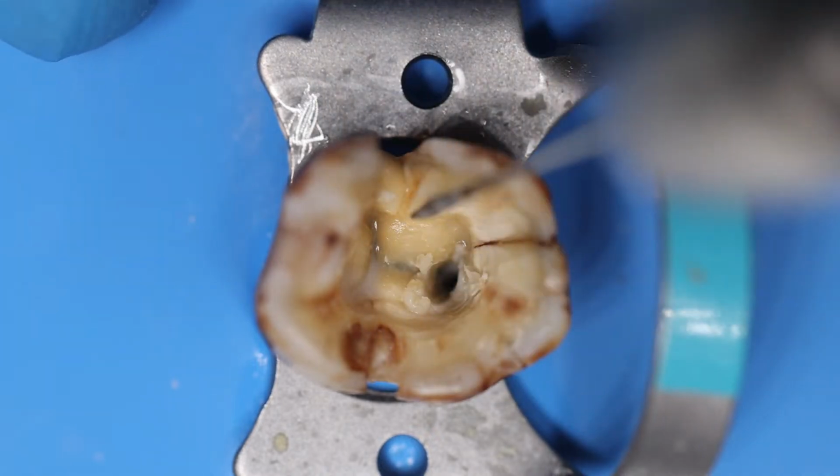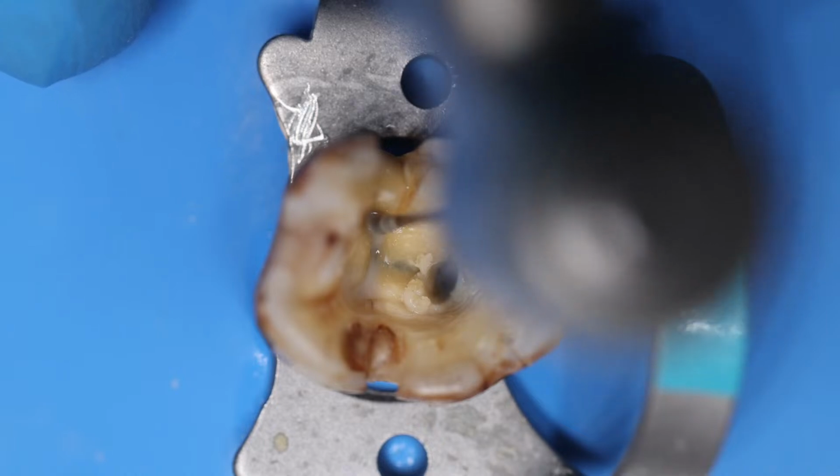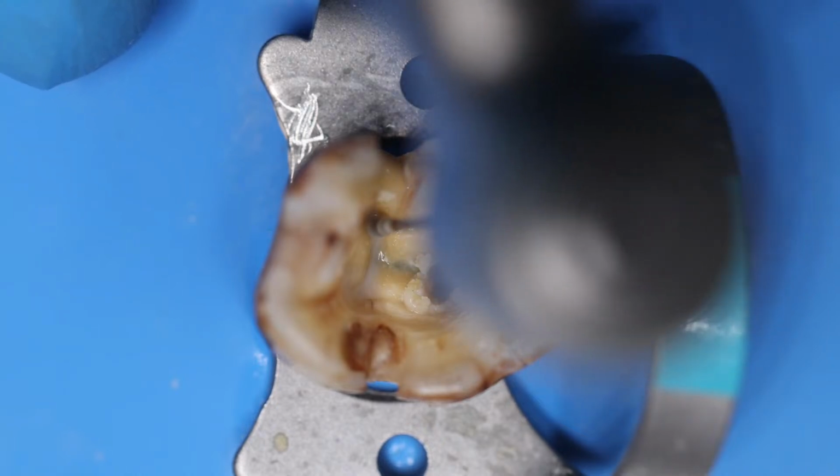and lead to fracture, I would prefer using it to get a proper visualization, and not much, just one size 1 or size 2. Based on the rings, you get to understand which size you are using.